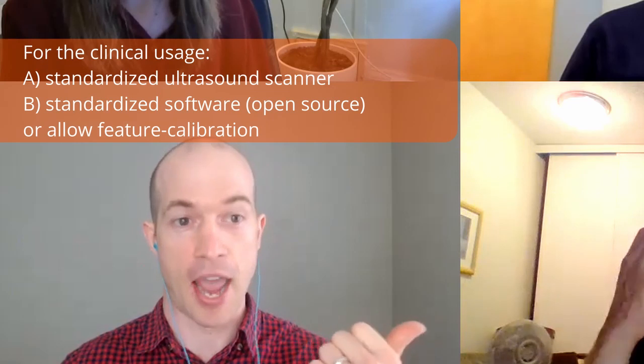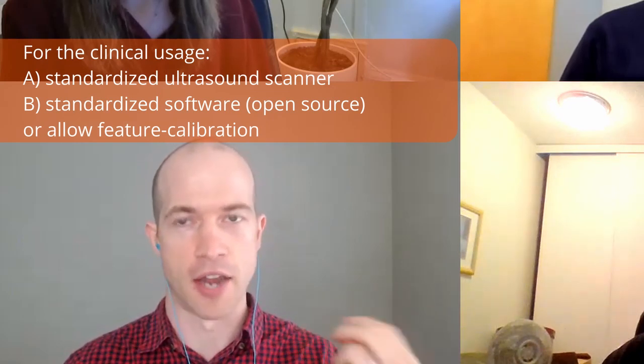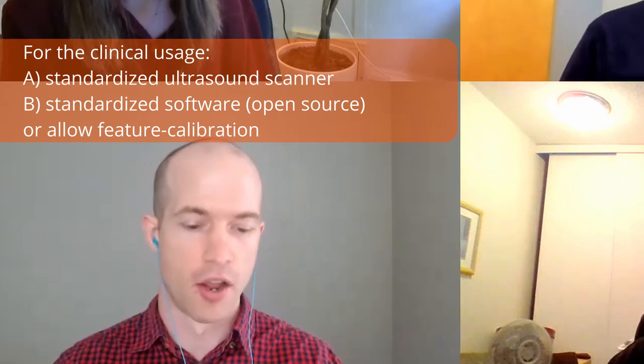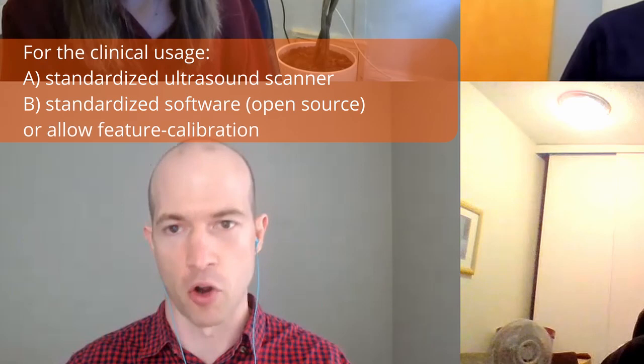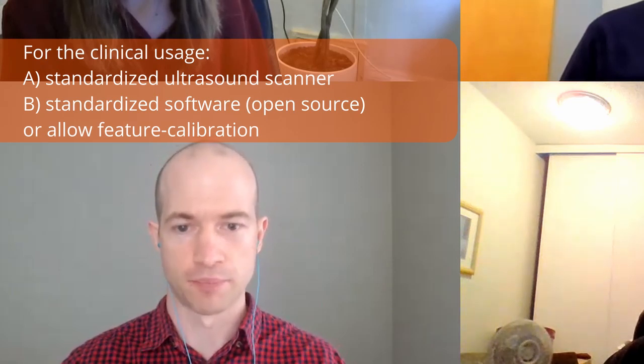So if we want to apply this clinically, we need to somehow standardize the scanners that acquire the images, and then have a way to standardize software, either by giving everyone the same open source software, or, if people are implementing their own approaches, by having images that we can calibrate everyone's software on.